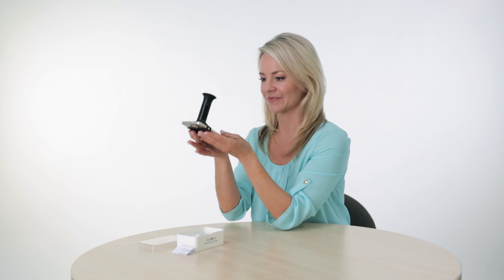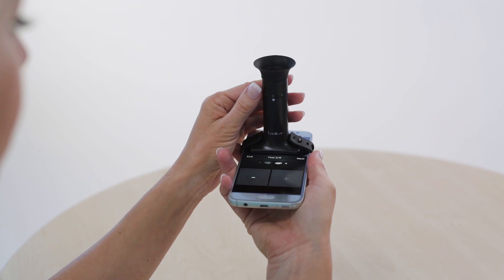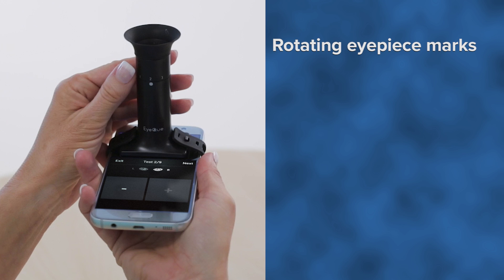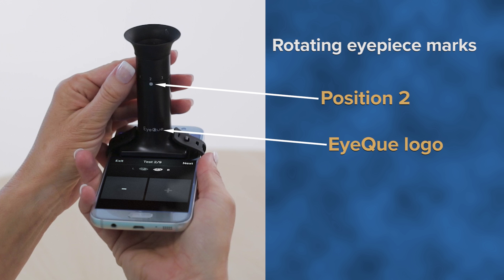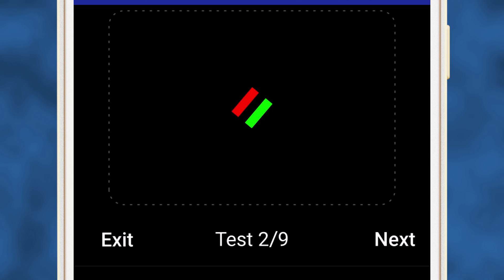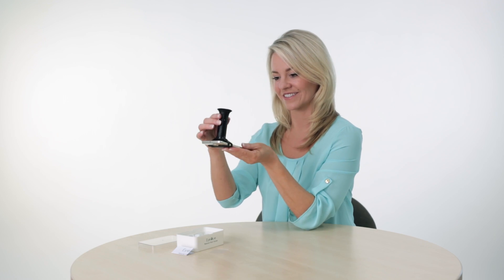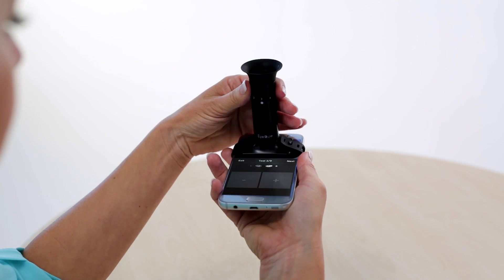That's your first measurement. Rotate the eyepiece clockwise one click to position 2. The mini-scope has markings on the stem to verify you are in position 2, meaning the number 2 is above the white dot located above the IQ logo. You will still be able to see the red and green lines, but now at a slightly tilted angle. Overlap them completely until you see only one yellow-colored line, then click the Next button to proceed to measurement 3.